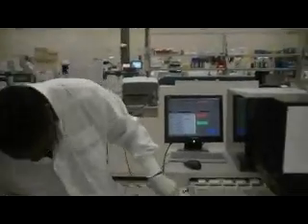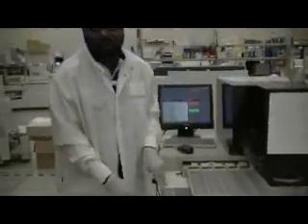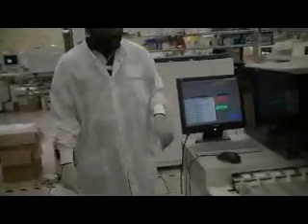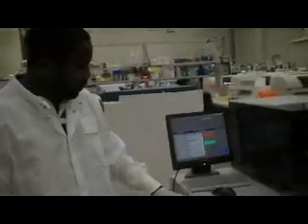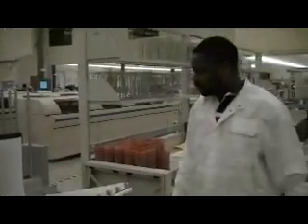You also have to check and see if the brakes on the machine are on, so that when it's operating it doesn't move away and pull the cables away. And you have to do a visual check on the machine to see if everything is still in one piece.